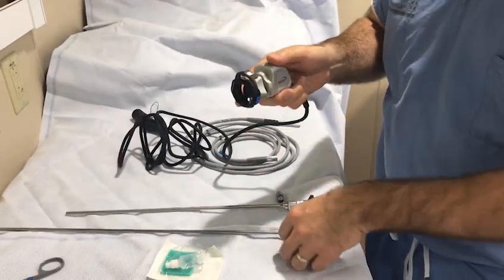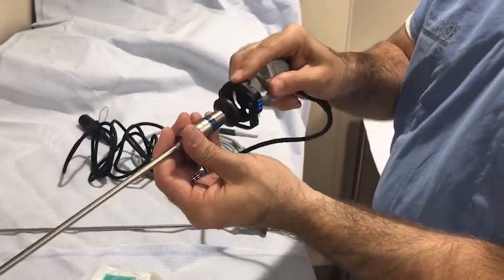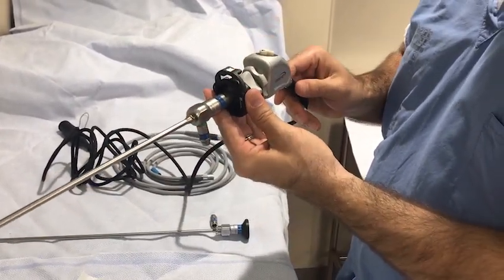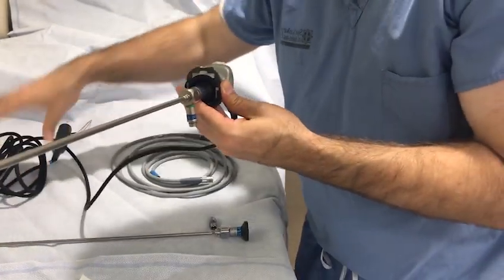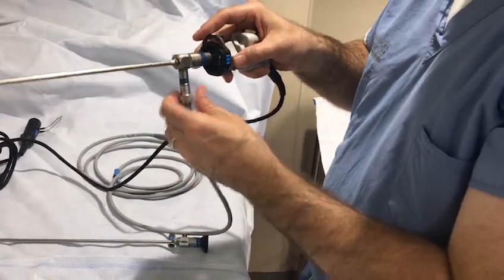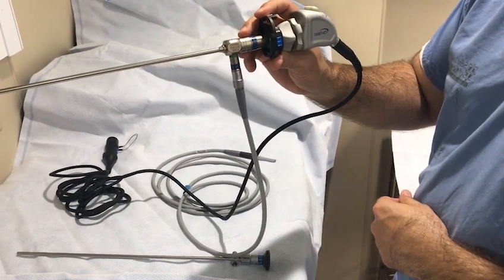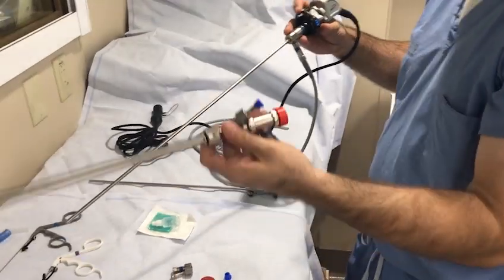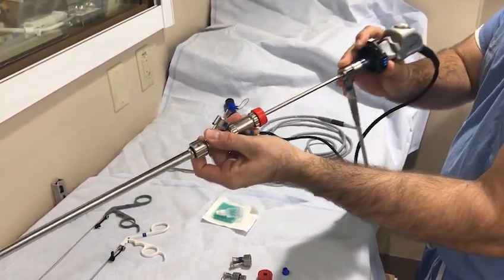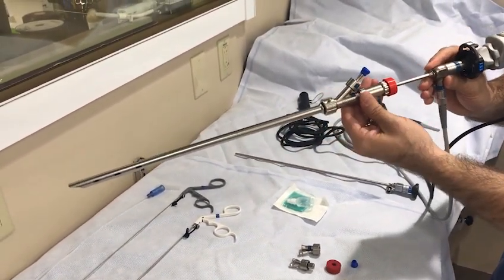Next, attach the camera to the lens on the telescope. Then attach the light source cable to the connector. Insert the telescope through the hole in the silicone cap until approximately 5 cm of the telescope remains protruding from the proximal end of the scope, and the tip of the telescope is safely covered by the barrel of the bronchoscope.